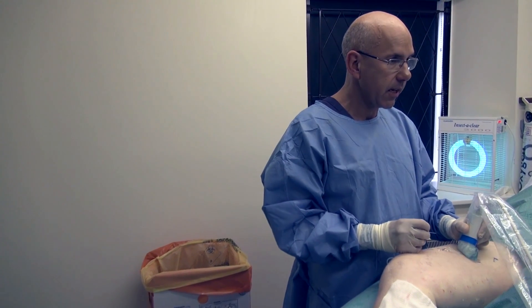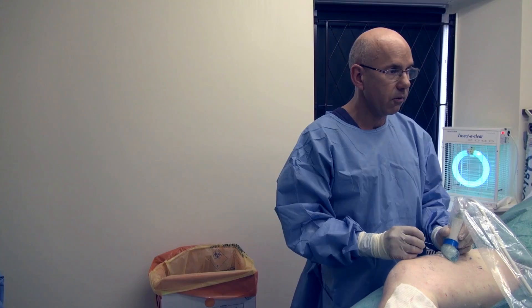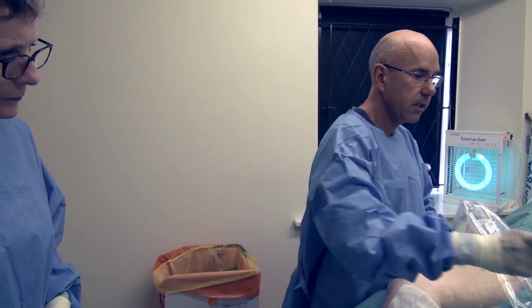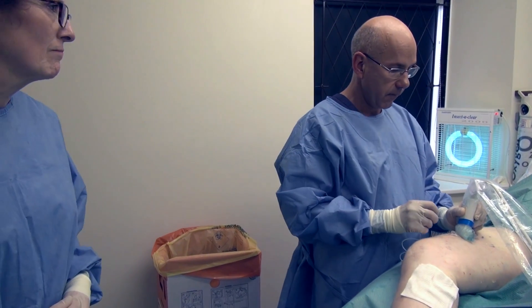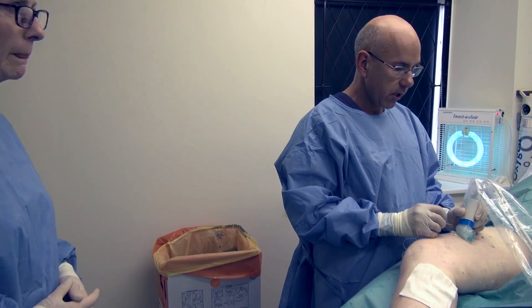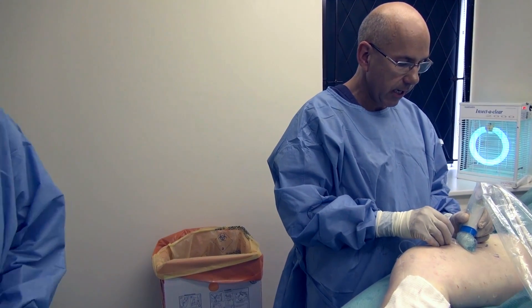I'm going to do it in a standard way. I'm looking at the offending vein — or the target vein, as I call it. I'm going to adjust the image on the ultrasound, and then in transverse section — my preferred method — I'm going to use the butterfly needle to cannulate the vein.